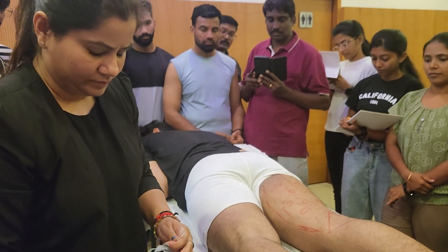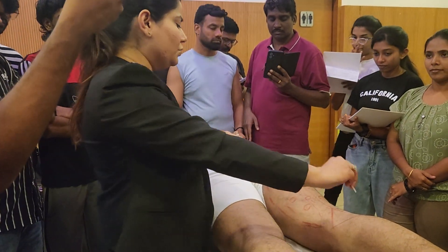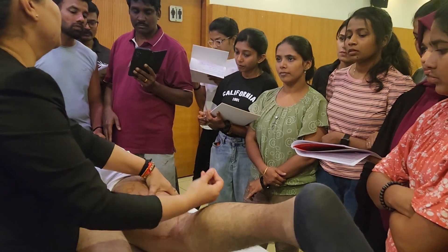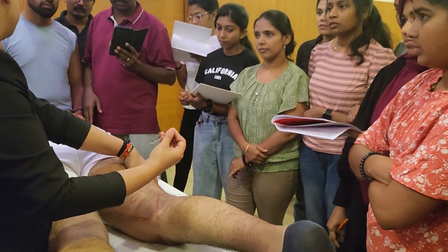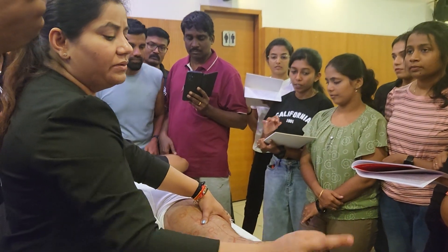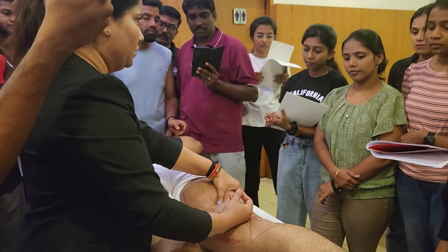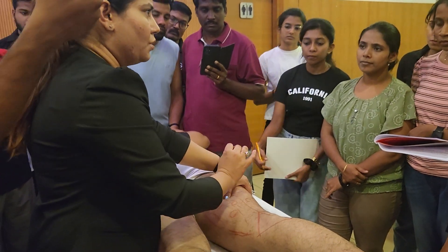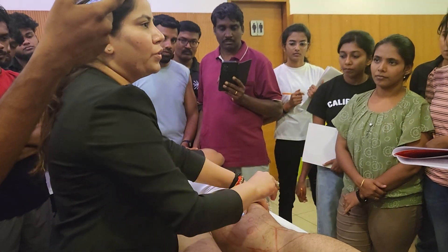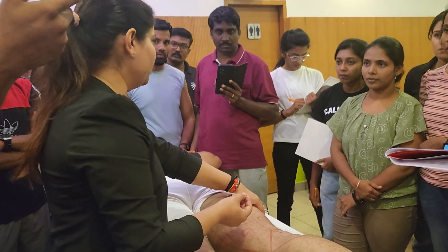The more you relax the muscle, the better will be the result. You will pick it up, and either you go away from the midline — cephalic or caudal. These are the three directions what you can do.